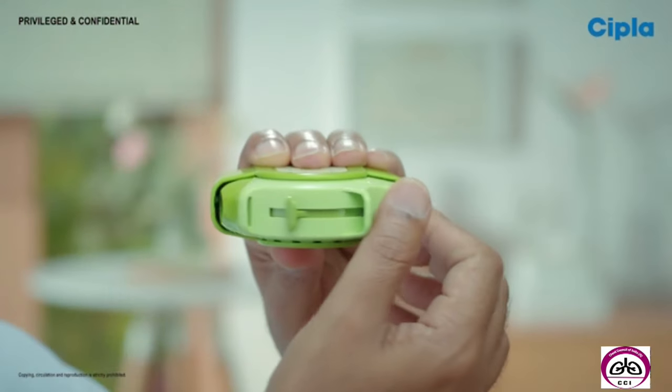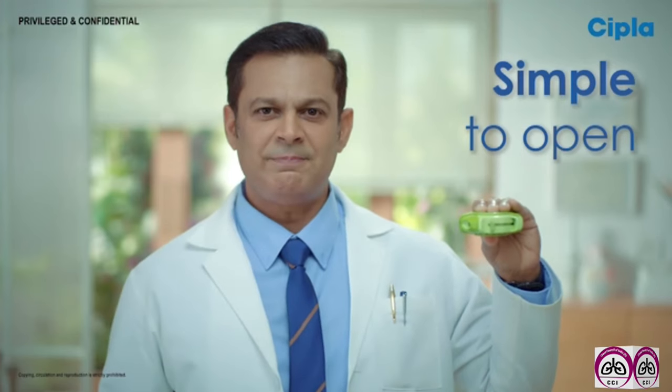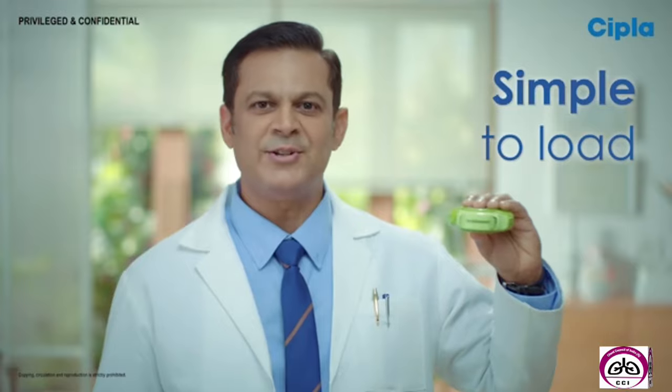Open the SipHaler by sliding the thumb grip as far as it goes till the top opens. Just an easy flip to open the device. Hold the SipHaler with the mouthpiece towards you. Slide this lever as far as it goes to load the device. And now, your SipHaler is ready for use.